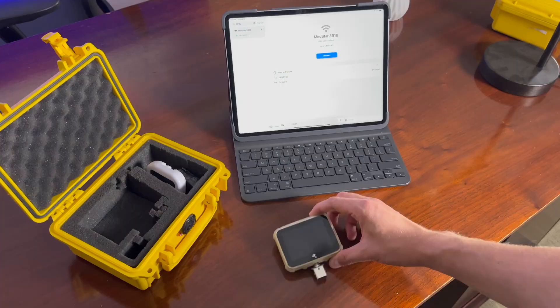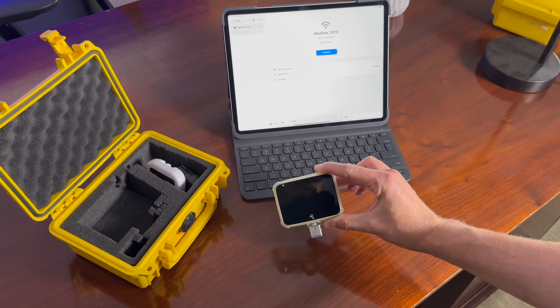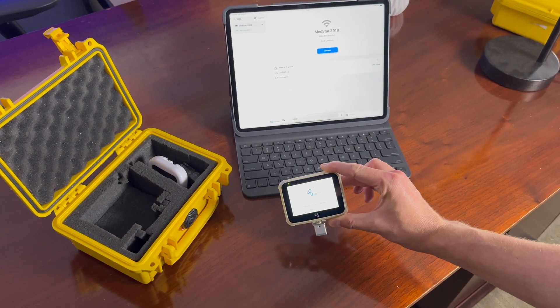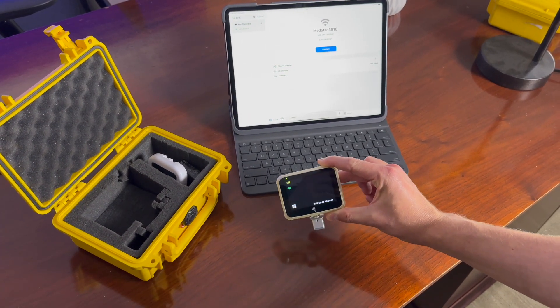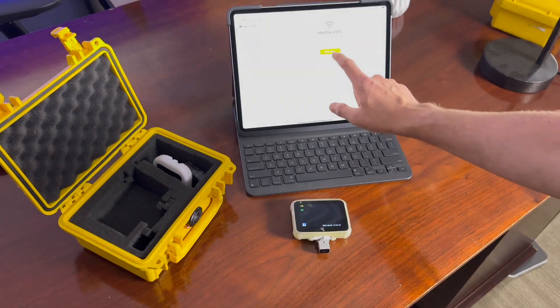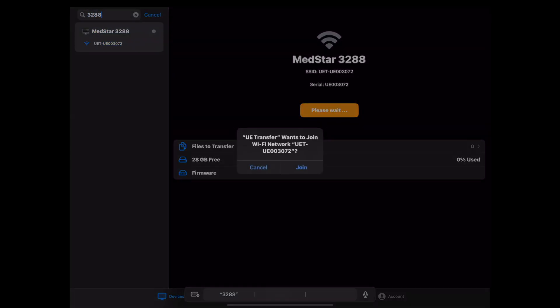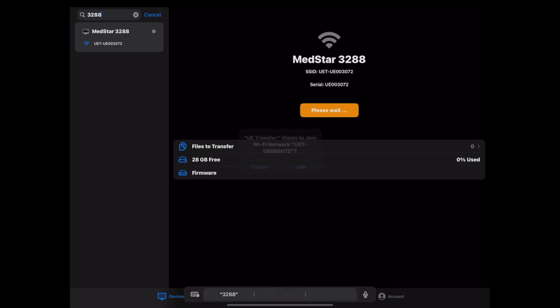Next, make sure the UE device is powered on and click connect to begin connecting to your UE Scope device. You will typically be asked a couple of Apple iOS security pop-up questions which you will respond with join or allow.